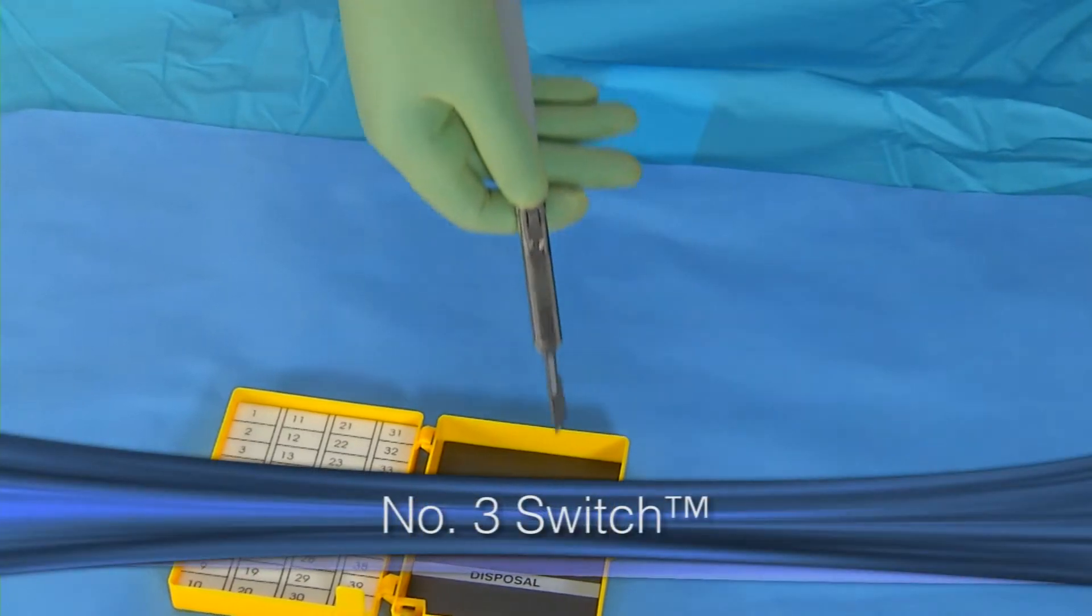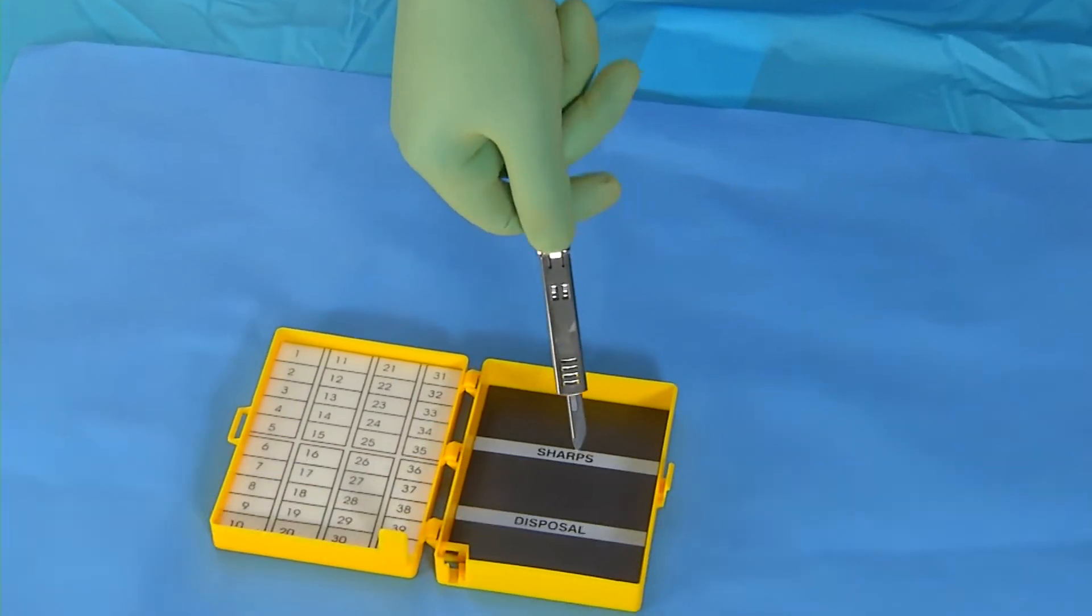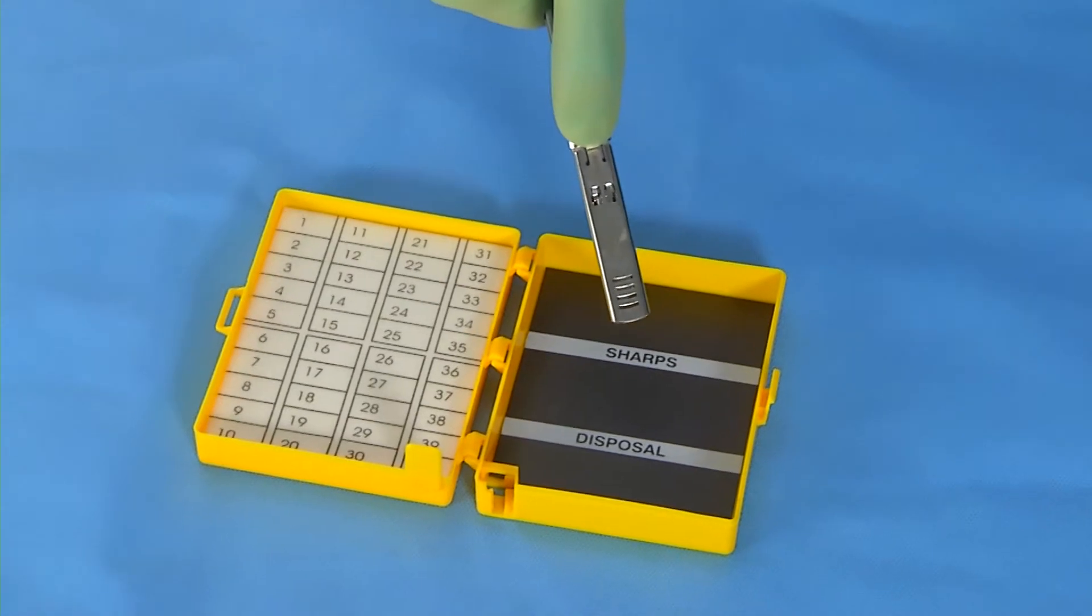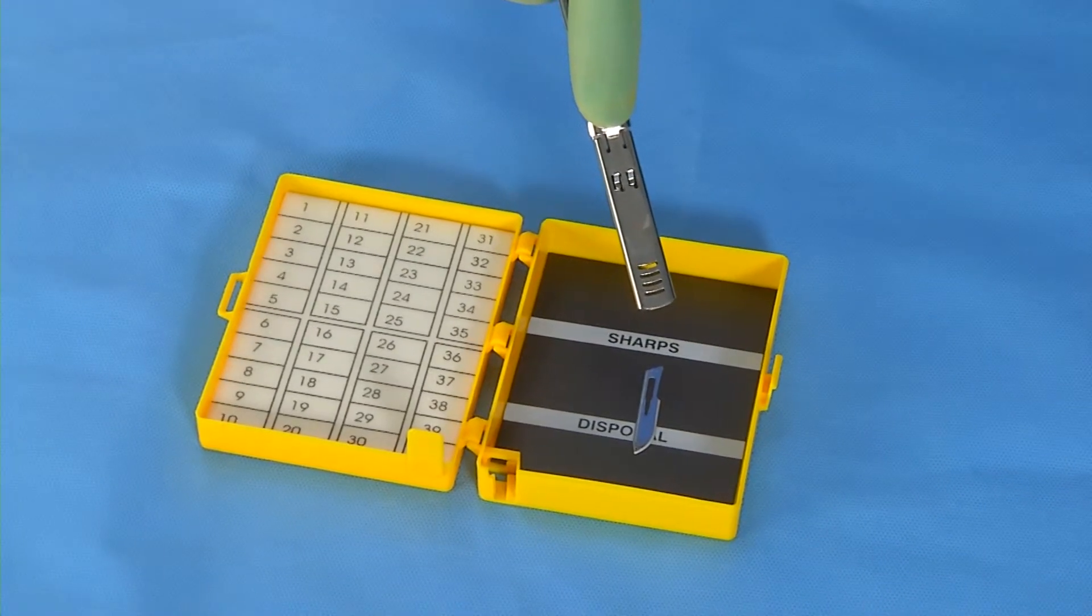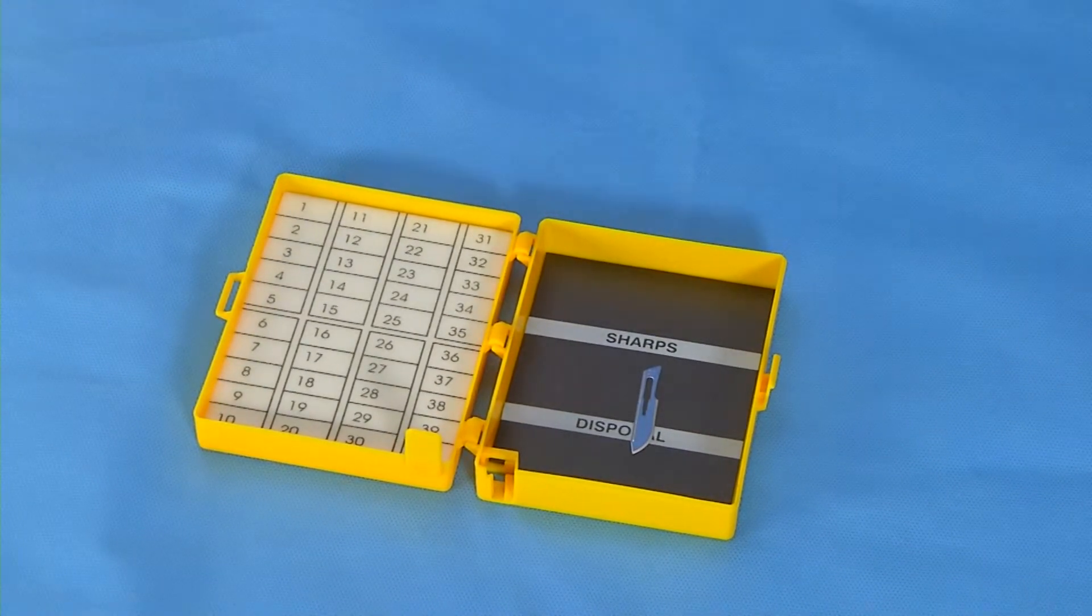Here is the number three safety scalpel. To remove the blade, push down on the side locking button and continue to move the shield until the blade is released from the handle and into the sharps disposal.